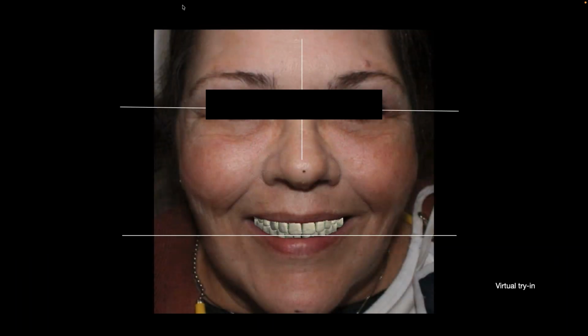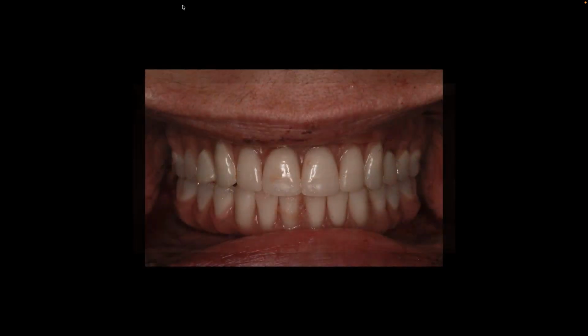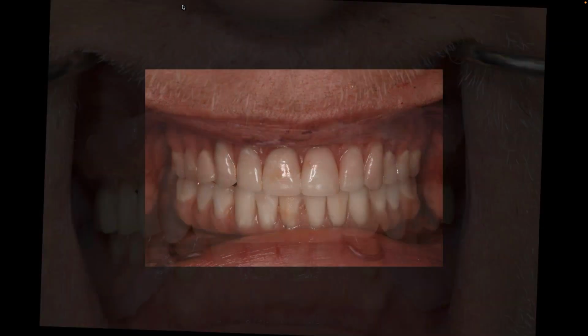And not just that, with the patient's picture, you can actually do a virtual try-in, put it inside the patient's mouth virtually, check everything, and then the patient went from this to the upper immediate, and actually the lower we converted, and then eventually the patient received fixed detachable on both upper and lower.